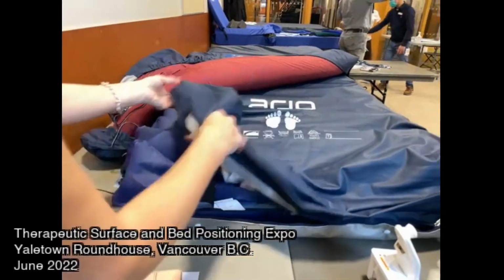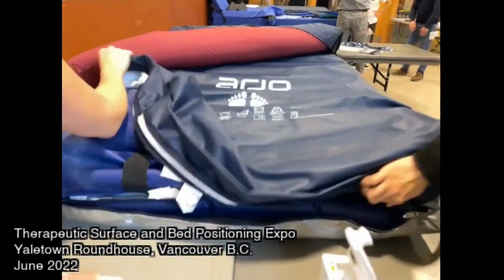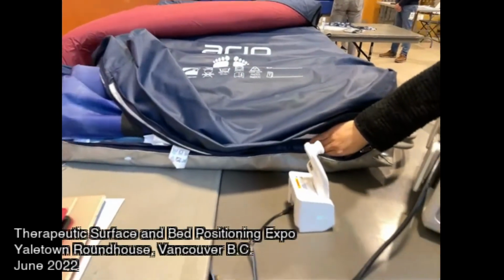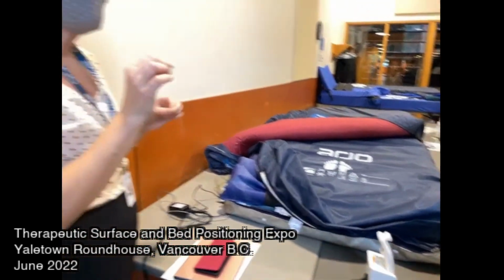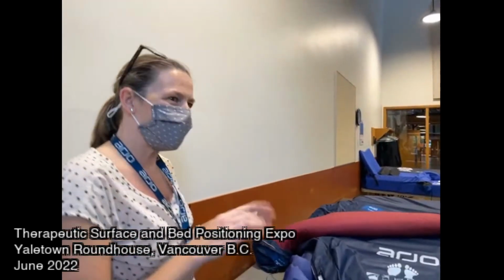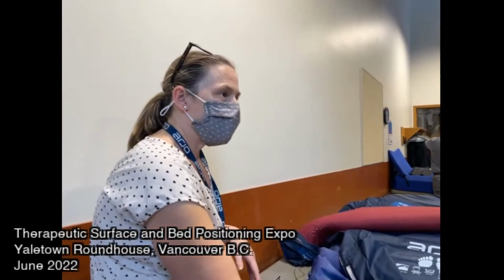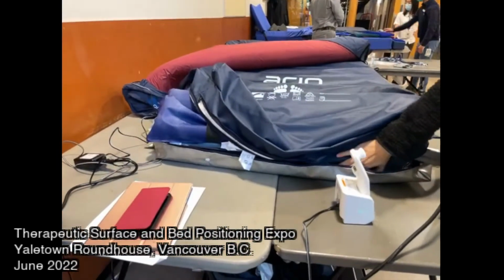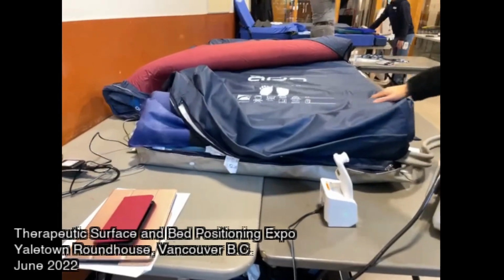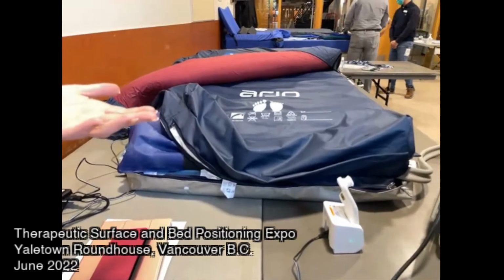And in the body area, there's actually different... Sorry, can I ask why there are two layers? The bottom layer is a sub-layer that has tiny perforations in it, micro air loss. It's not for keeping the skin cool and dry. It keeps the whole mattress cool. So this doesn't alternate? No, just the top. And it prevents bottoming out, if you bottom out onto an air surface.